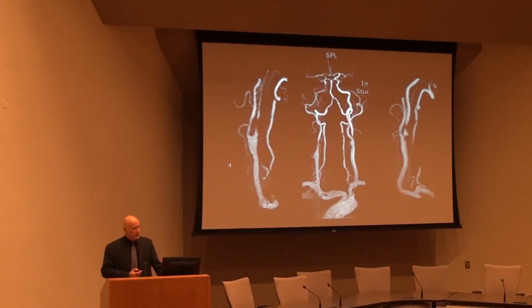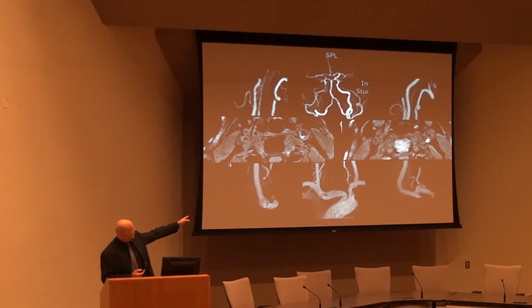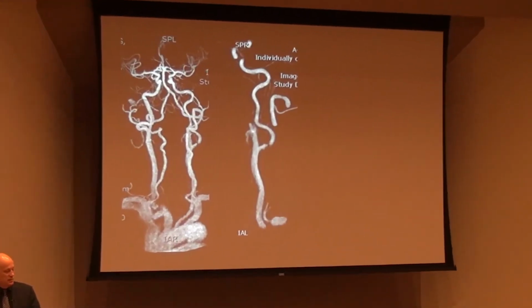And now we want to know what's actually causing that disease. On the cross-sectional image through those carotids, looking at the left-hand carotid, you can see that high signal within the vessel wall representing hemorrhage. On the right-hand side, we just have a rather bland image, which suggests there is no hemorrhage. So we're starting to pull out risk factors within each of those stenoses.